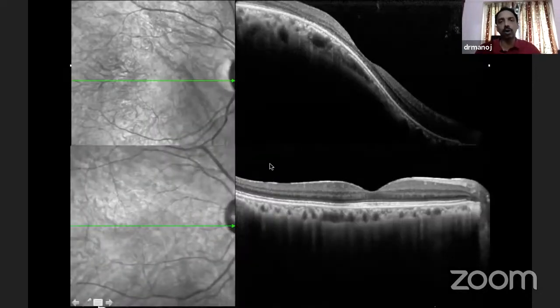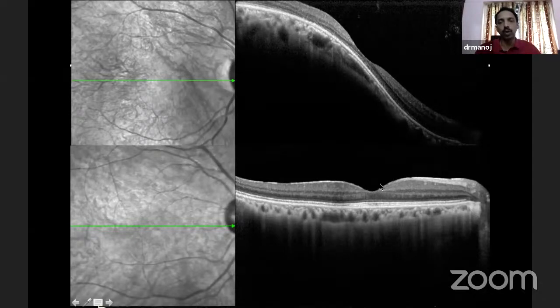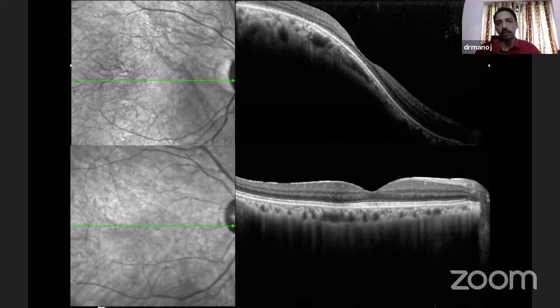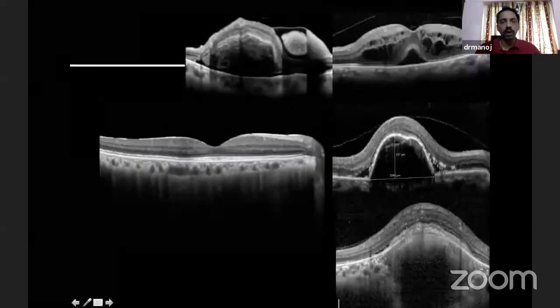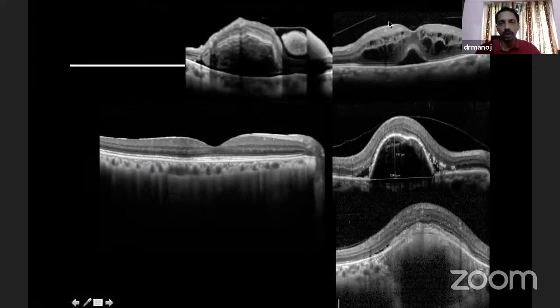The second thing is looking at the contour. This is how a normal retinal image would look like, but here the generalized contour of the image itself is altered — so you understand this is a patient with myopia. In myopic eyes, the contour may be altered. Then look for any focal change in contour — here, the contour is changed in the macular region alone in all these entities.